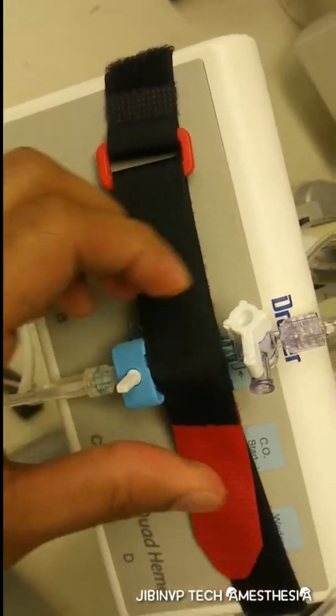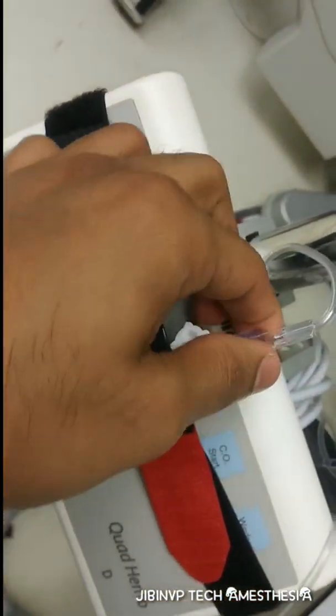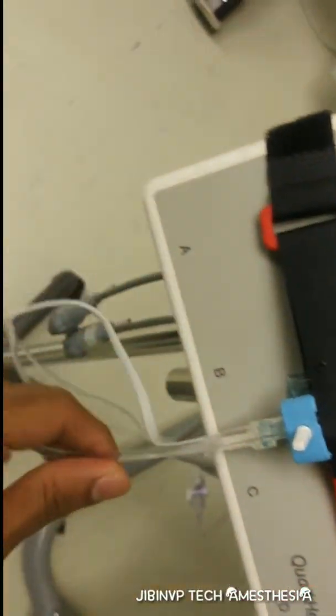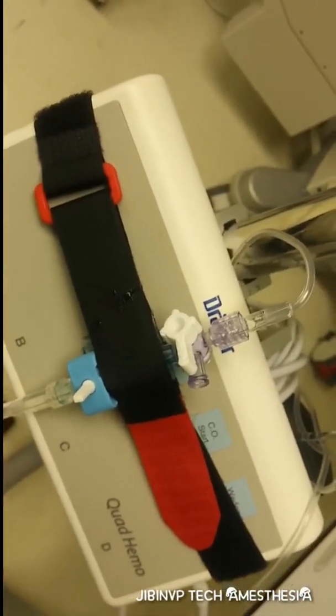We should check that all three-way stopcocks and connections are tightly closed, otherwise there will be leakage and you will get error readings in the real-time monitoring.